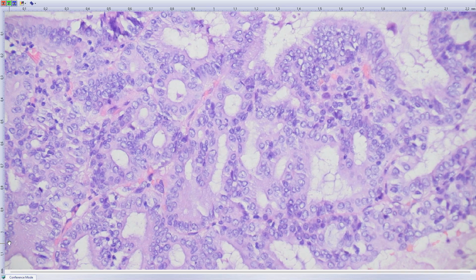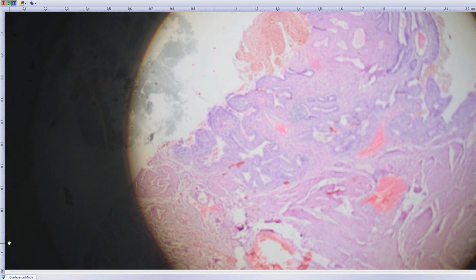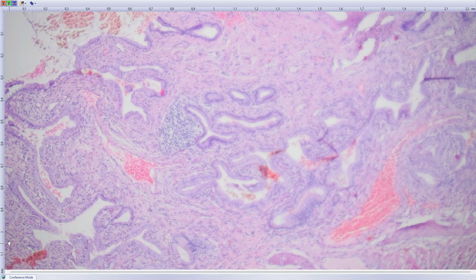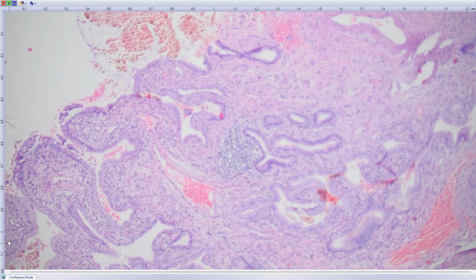So I believe I've got another slide. It's from the wall of the gallbladder next to the lesion. It's gallbladder, and it shows signs of not very profound, but it's cholecystitis there. So this kind of lesion always occurs in an inflamed organ, whether it's gallbladder or stomach or some other parts of GIT. And the lesion is called pyloric gland adenoma.